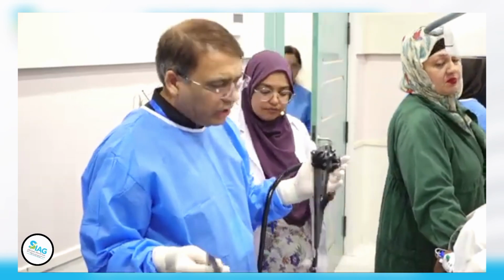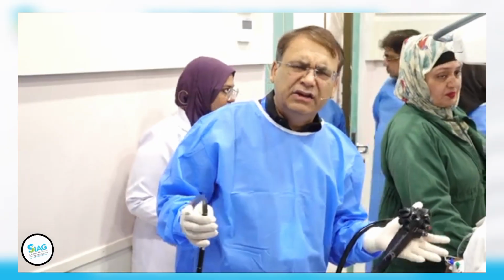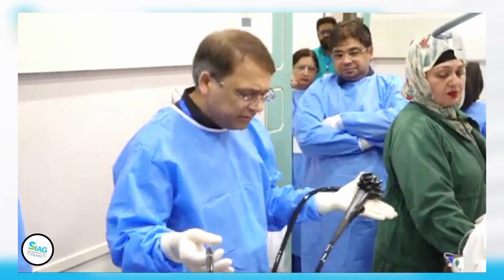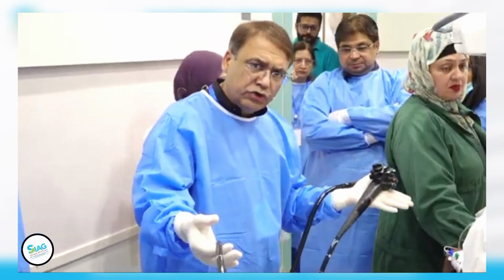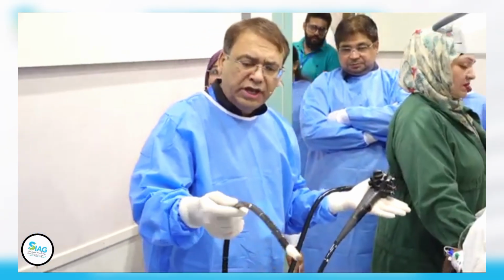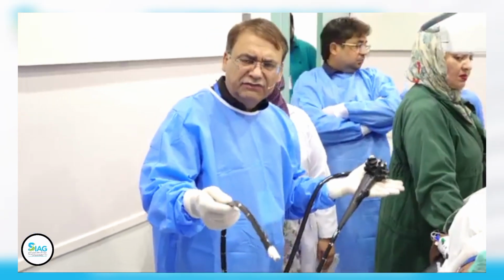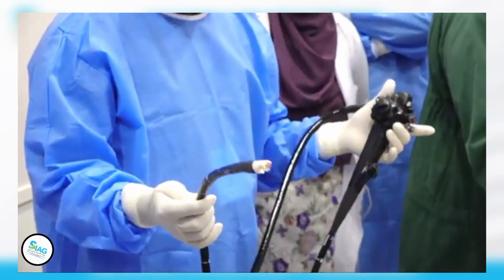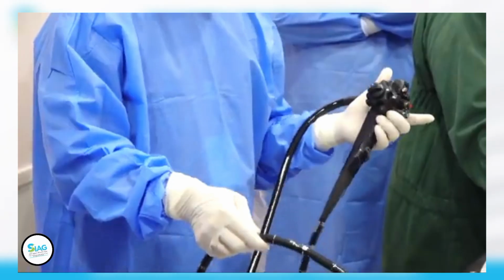Okay. Thank you. So there is a stent that is going to create a little bit of artifact, but that should be okay. Holding the scope, this is what I call the neutral position of the scope, holding close to 25, between 25 and 30. I already checked the balloon. We had to change the balloon because it was leaking.